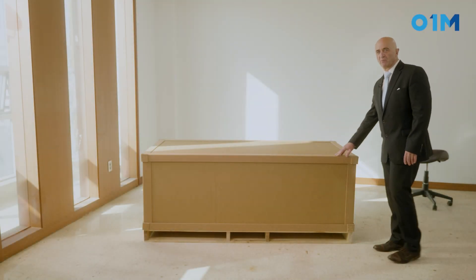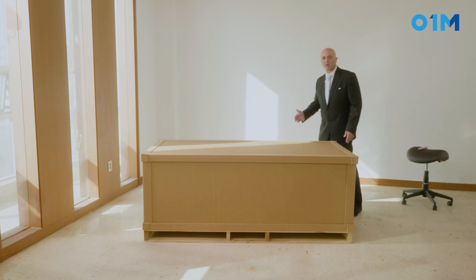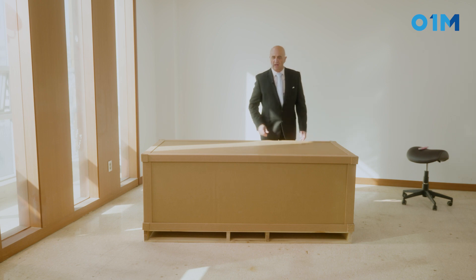You just received your table and I'm going to show you very quickly how you can set it up by yourself without any problem.